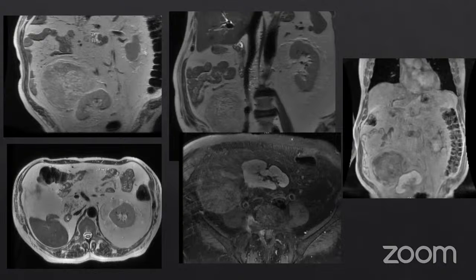Yes, so one we got is liposarcoma, Dr. Seema, with perirenal lipomatosis. So definitely the correct part of it is there is fat component along the perinephric area. Perinephric fat is abnormal. Angiomyolipoma is one of the differentials. So here this is bilateral perirenal liposarcomas. Dirty fat, heterogeneous appearance, it's not only lipomatosis, but there is something else going on. And this is perinephric liposarcomas.